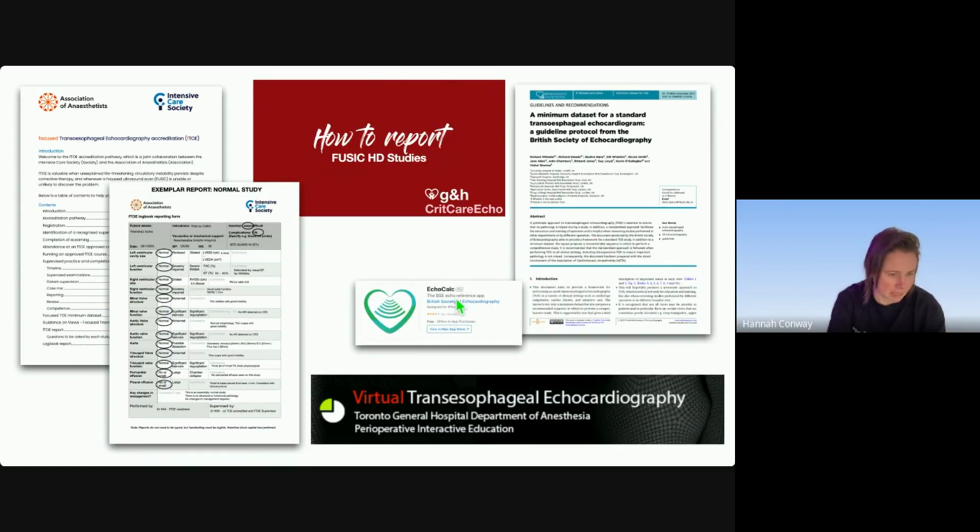The EchoCalc app, if you haven't already downloaded that, make sure you do. And to refer back to some of the things we might not have covered, for example, when I did the talk on FUSIC HD studies, I put a section at the end on technical difficulties that you might have with the scan and how to report them. It's not something you'll come across very often with focused TOE because there aren't as many technical difficulties, but there are instances where you can't get good images. That particular talk, which is on the TOTEM YouTube page, has some examples.